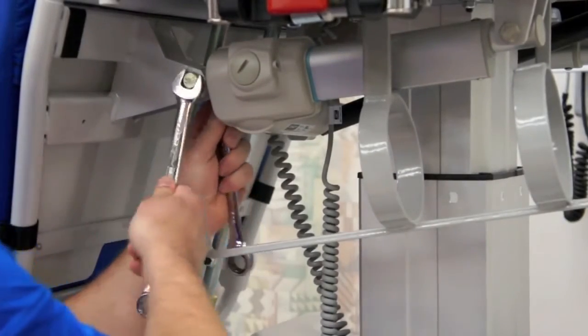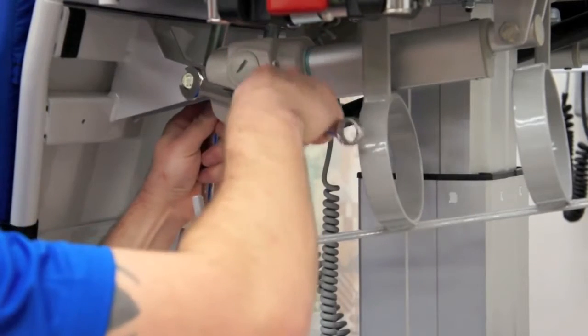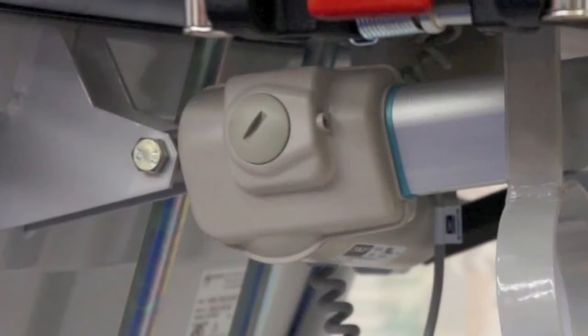Next, with the two wrenches, remove the nut on the front part of the actuator. Leave the bolt in the actuator. This will help support the actuator while you are removing the nut and bolt on the back of the actuator.